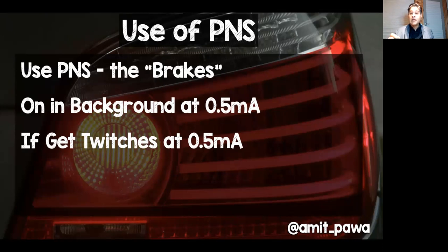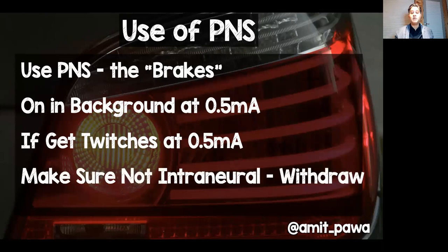It may be that the needle is much closer to the nerve than it needs to be. Make sure you're not intraneural. Withdraw ever so slightly. If you withdraw ever so slightly and the twitches disappear, you can administer your local anesthetic at that point. So that's something to think about.